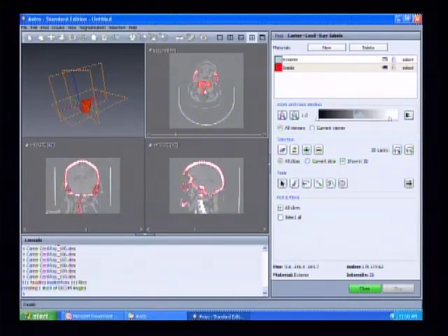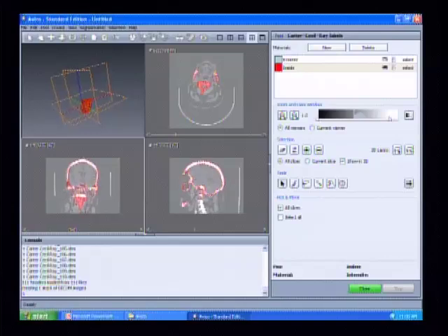I think for me it's hard to see up here, but you can kind of see that it makes a mesh of the vertebrae that I have. You can see in this view that it's selected the vertebrae at the bottom. And so you can scroll through and see all of that red that's selected. So I've just now selected that entire volume.